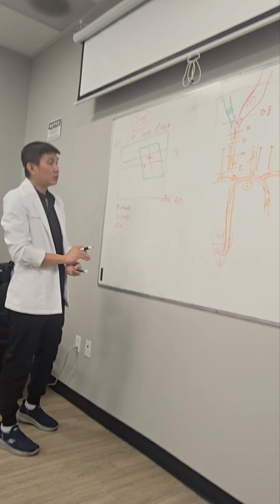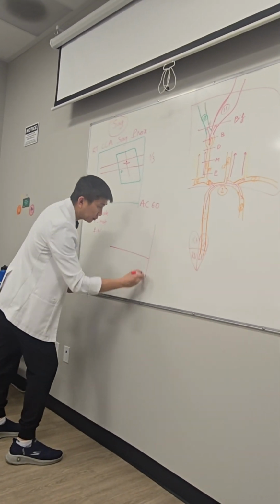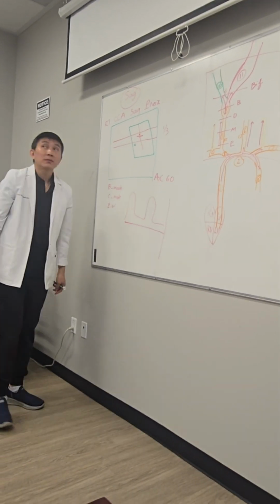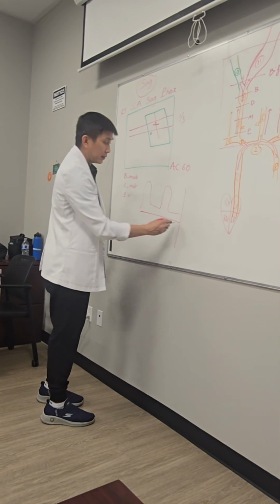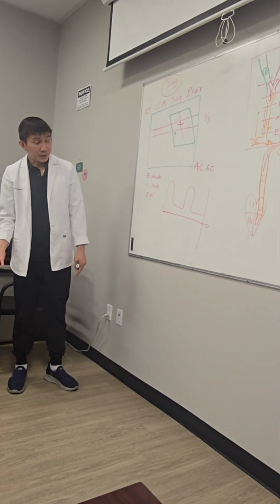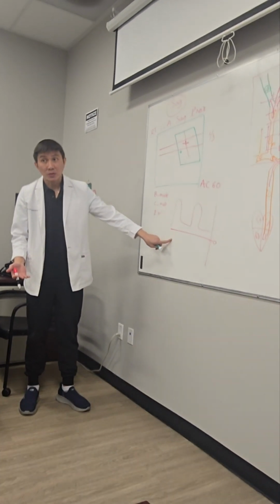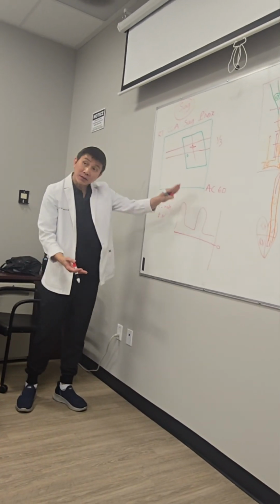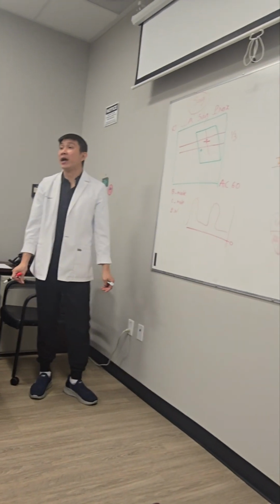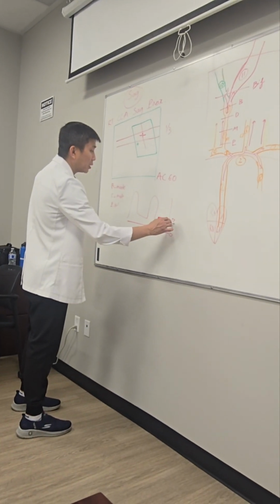Alright, so when you take this one, you're gonna see the waveform right here. This here we call the baseline. So for the artery, below the baseline there's very little signal. So you bring the baseline down. So this means you don't see this.